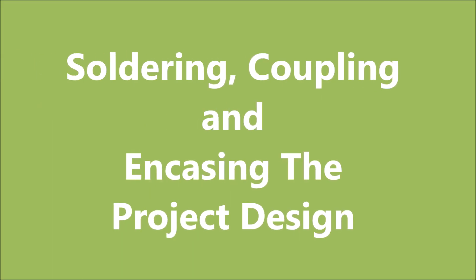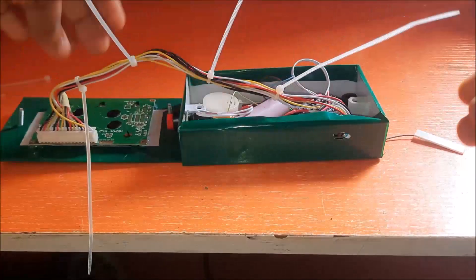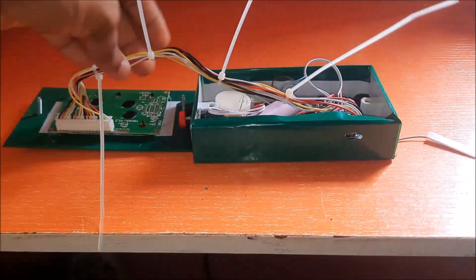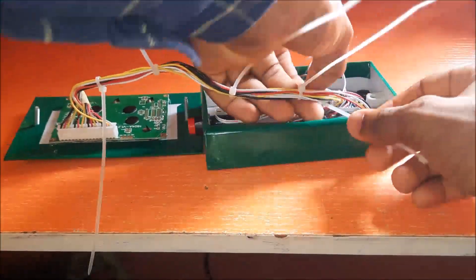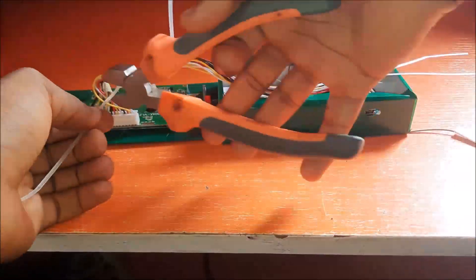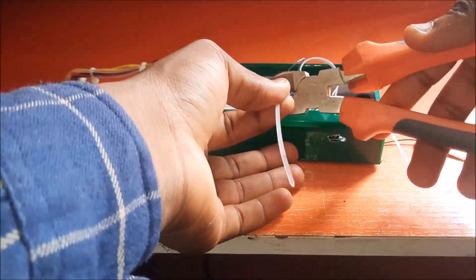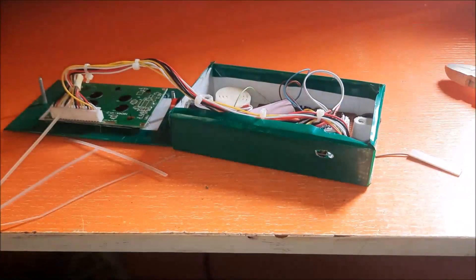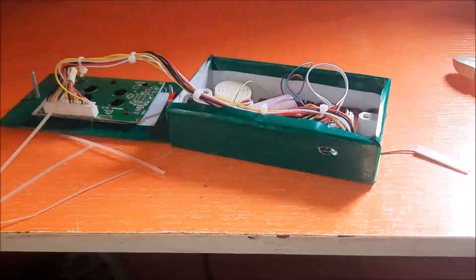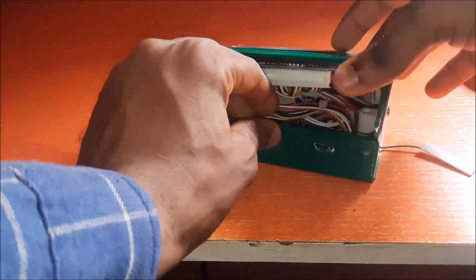Once we have fully understood this schematic diagram, the next step is to proceed to solder, couple, and encase the project design together. This is the coupling phase of the IoT-based health monitoring system using Arduino. The enclosure is made from a 3 by 6 inch polyethylene box. The soldered components are placed inside at the right angles. Some openings were cut on the plastic box to ensure external connections to the ports and jacks that needed to be connected from the outside.